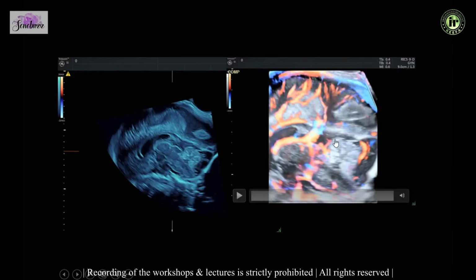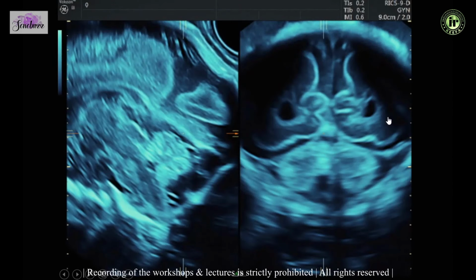And you can also see the blood supply of the cerebellum and the pericallosal artery in this particular view. So a lot of 3D surface rendered techniques to capture the volume, as I showed you earlier. You can see the calcarine fissure here, the occipital horns, the cerebellum, the tentorium. It is so well highlighted on the surface rendered 3D imaging. And then we measure the angles. So that is the brainstem Vermian angle, the brainstem tentorial angle.